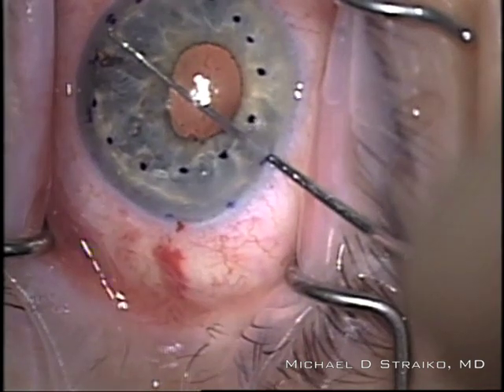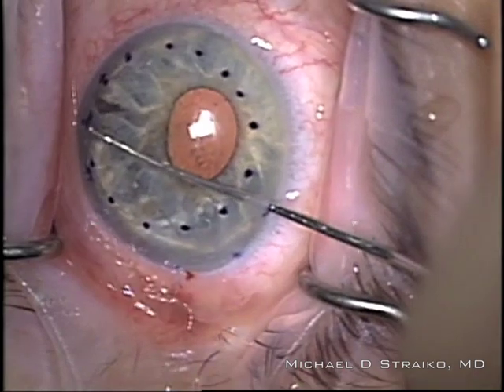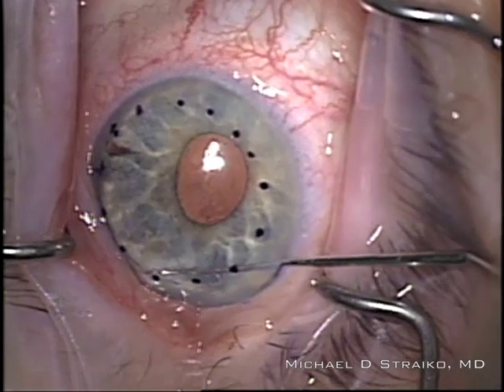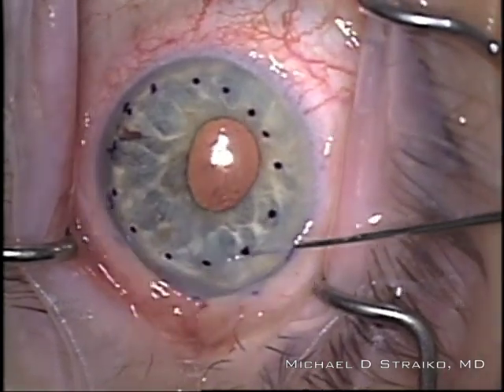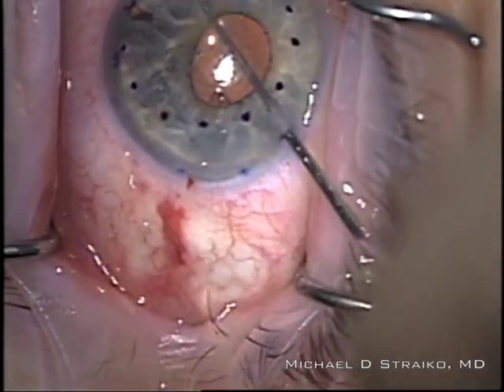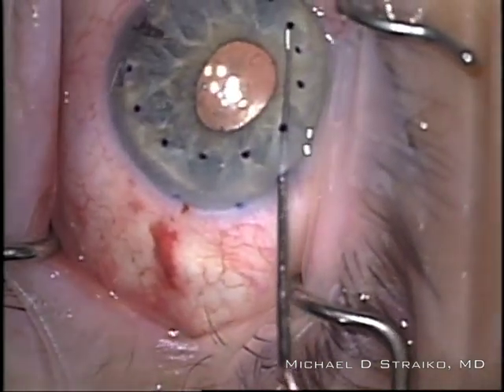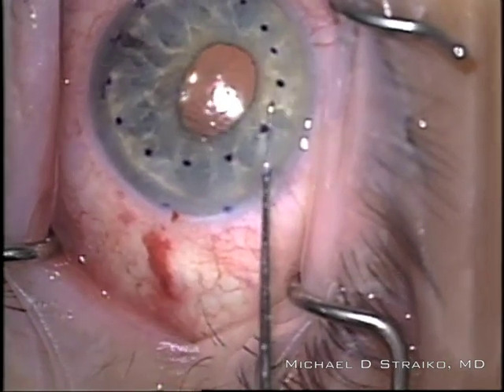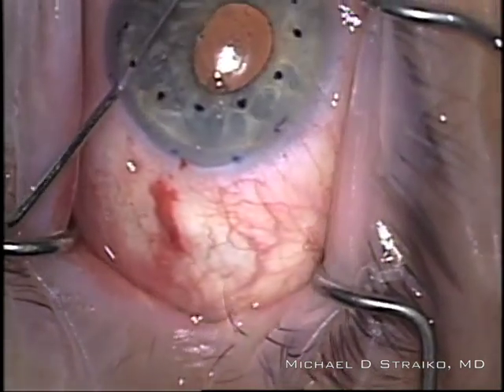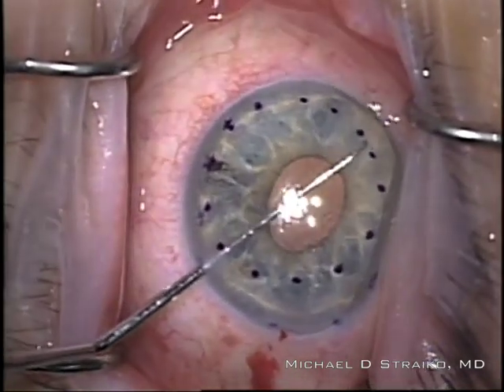Using a reverse Sinski hook, I go right along that line. I really want an 8-millimeter resection. With DSAEK I tend to strip inside of that, but with DMEK I like to go all the way out to my 8-millimeter zone. I really take my time with this step. I want to make sure that I just break Descemet membrane and do not engage the stromal fibers. I want to have as smooth a bed as possible without any stromal fibers that could get in the way of adherence.